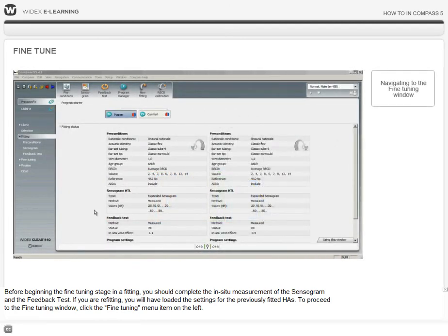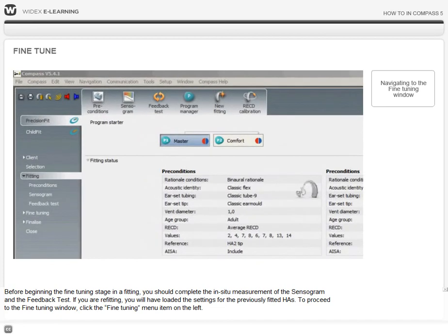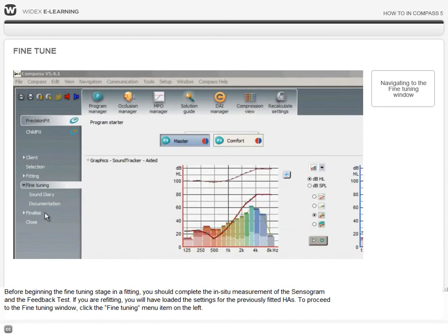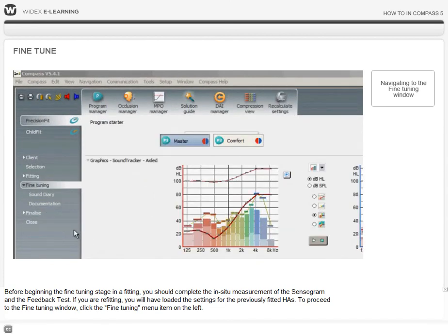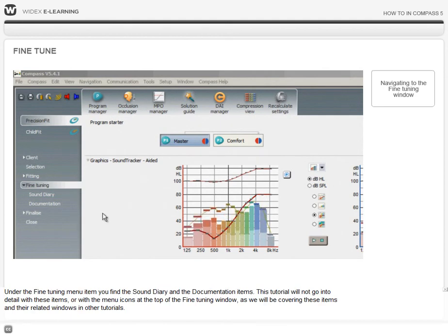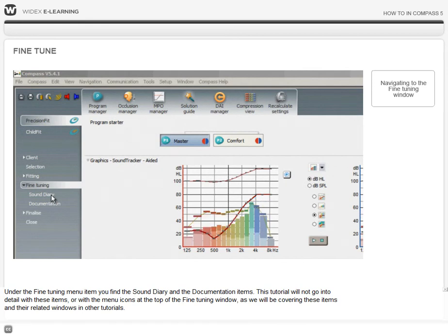To proceed to the fine-tuning window, click the fine-tuning menu item on the left. Under the fine-tuning menu item, you will find the sound diary and the documentation items.